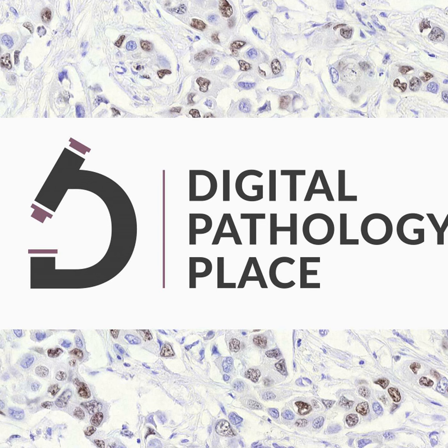You'd have CT scanners coming on the market that would store and share their images in a proprietary format, and yet need to be used on third-party workstations or stored in third-party archives. So if you had, for example, a General Electric CT scanner and a Siemens CT scanner and a Philips CT scanner, they would put out different formats and they would not be compatible with each other's workstations and archives. And this was recognized to be a problem, especially when you were spending many millions of dollars on it.